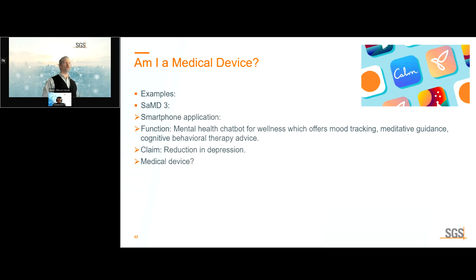Now it's a mental health chatbot. This is not theoretical. These objects now exist, even ignoring the LLM models that have lawsuits against them these days. So not those. There are professional medical ones that now will converse with the user, give mood tracking, might guide meditation, cognitive behavioral therapy advice, tell people what to do, how to think about their situation. It makes a very specific claim, which is reduction in depression. So is this a medical device? Again, yes, it is, or no, it isn't.